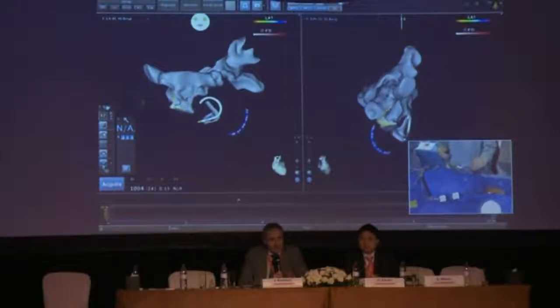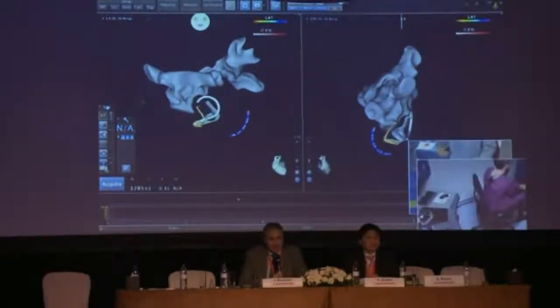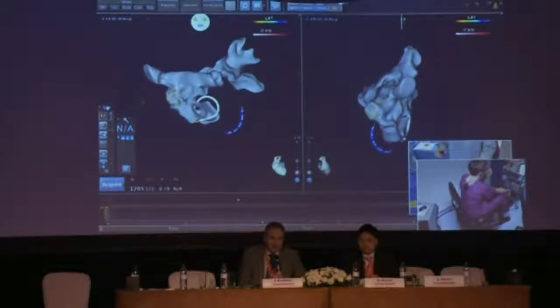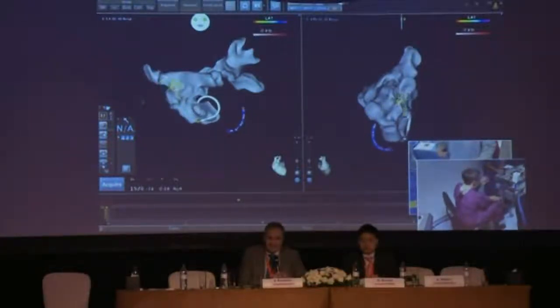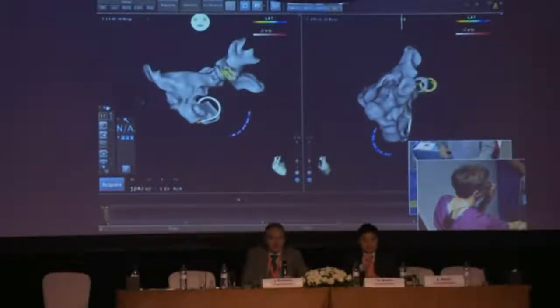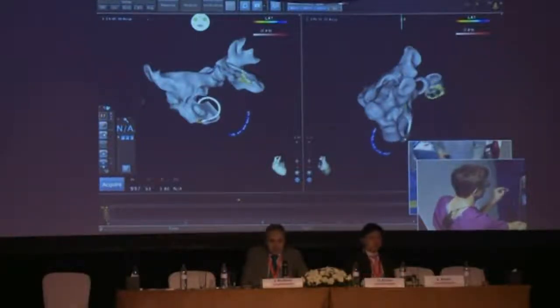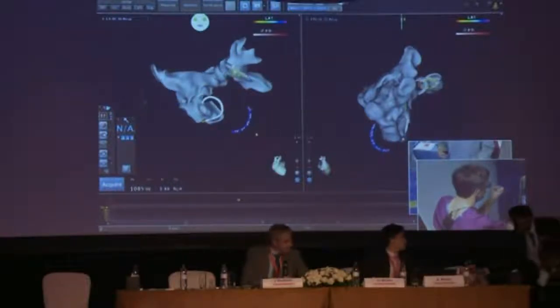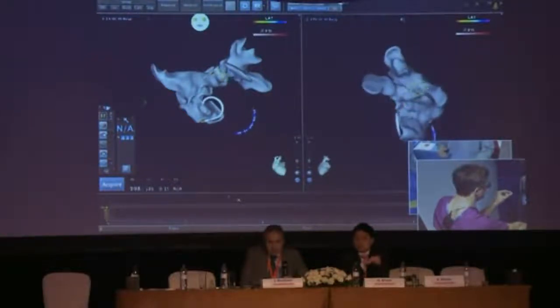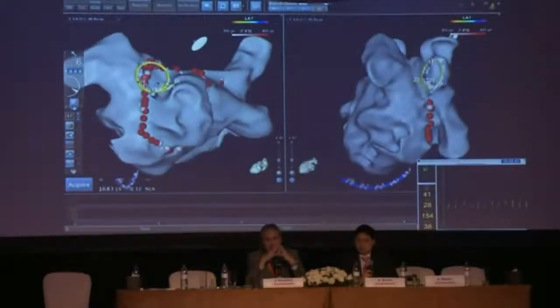So you can tell your view, and I can maybe comment from my side. So you can start. Question number one, what's the difference between this and stereotaxis? With the more energy you deliver and the more force you deliver, the better the lesions, the better your chance of success. The less force and less energy you deliver, the safer the procedure is, but the less chance of success. In my opinion, the major advantage of this system, specifically for AFib ablation.